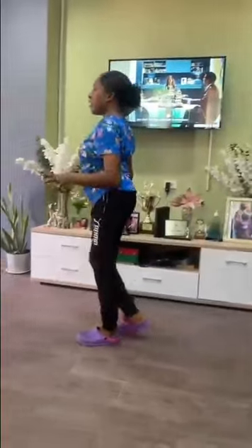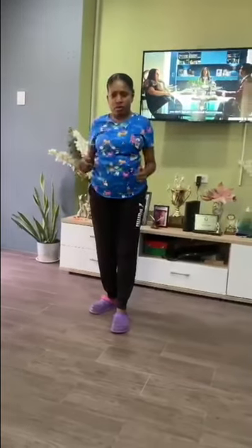Now that the area is all clear, free from any clutter, any rugs, anything that would trip our client, let's move on to the client themselves. So, it's very important to assess the patient when selecting which assistive device is right for them. So today our client has a sprained ankle. That's not so bad, but she will need something to help her move about, to help bear her weight as well as ease her pain.